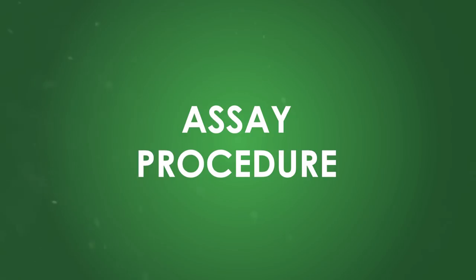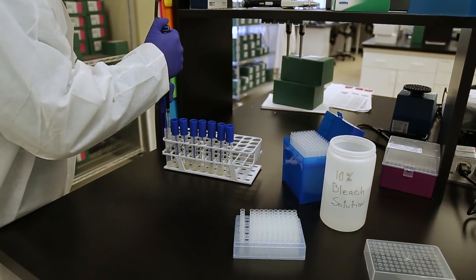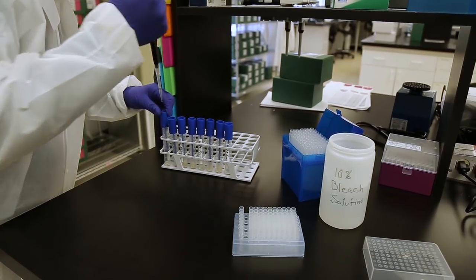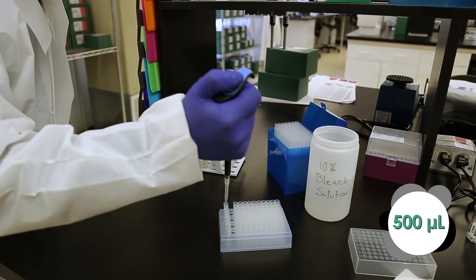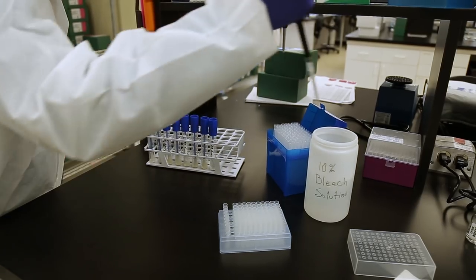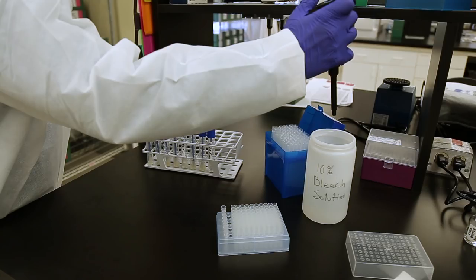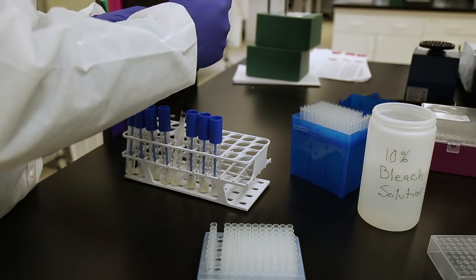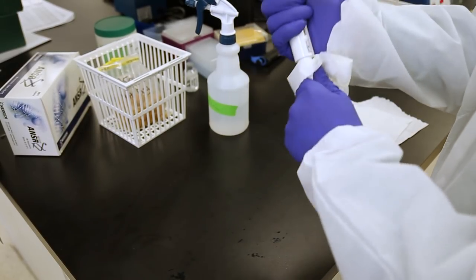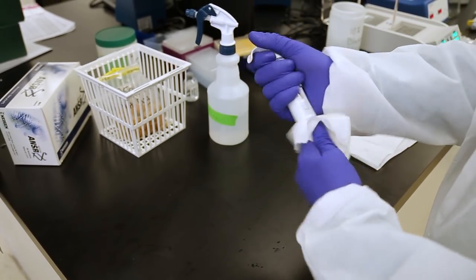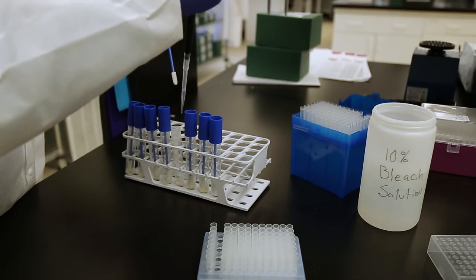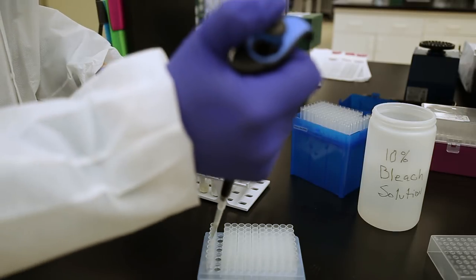Assay procedure. Using the long pipette tips and taking care not to touch the inside of the tube with the pipetter, pipette 500 microliters from the tube to the correspondingly labeled cluster tube. Eject the pipette tip into the 10% bleach solution. If you touch the pipette shaft to the inside of the tube, give the pipette a wipe with a paper towel soaked in 10% bleach, dry, and then proceed to the next sample.